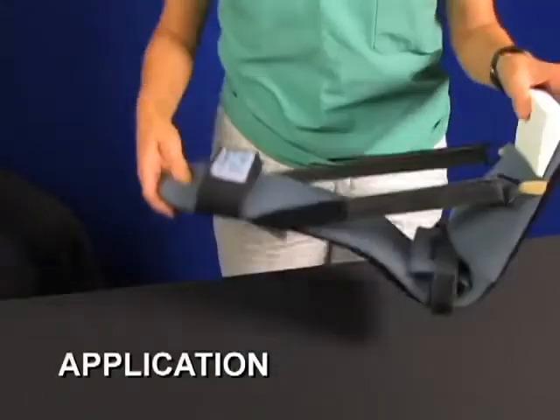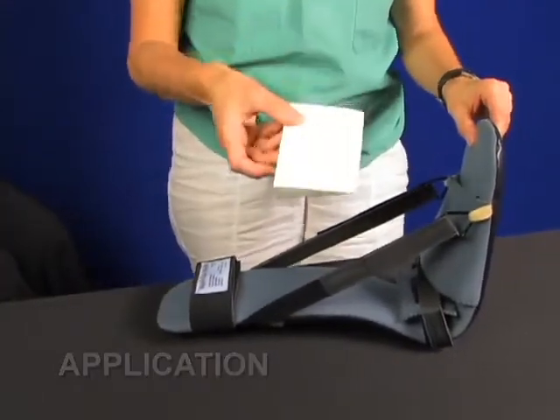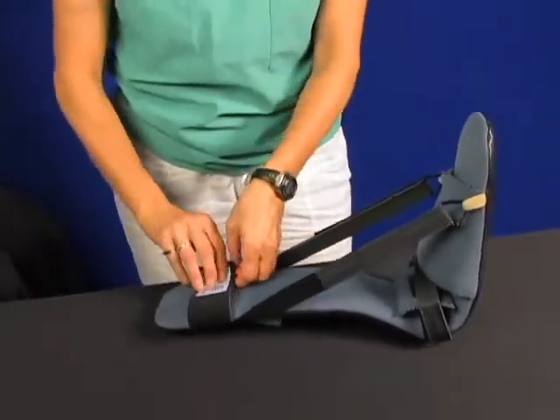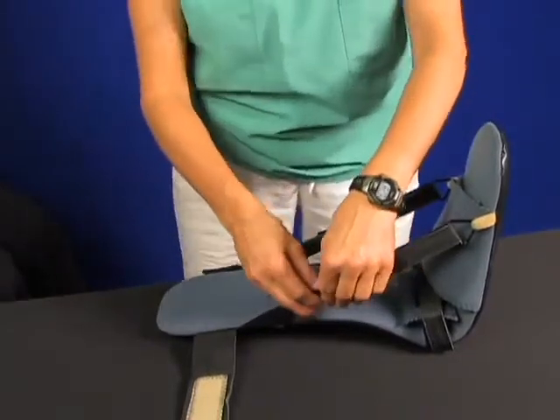The multi-use boot arrives with the foam dorsal wedge for the toes in place. To begin the application, remove the foam wedge. Next, you can release the calf strap.